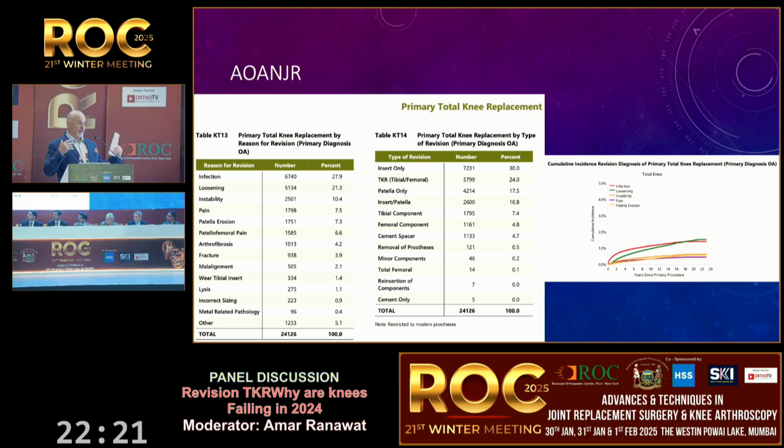So I agree with you. I do compression all the time, but when is it not a good idea to do? In rheumatoid knees, if you extend it, sometimes you can have a fracture. That's one problem. Exactly. What else can happen? It's a read-my-mind question to some degree, but I think if your knee is unbalanced and you're, say, very tight medially, and you do the compression, it's going to compress the medial side, but you're going to lift off on the lateral side, right? So unless you get the balance first with your trials, you shouldn't cement your implants in an unbalanced state.